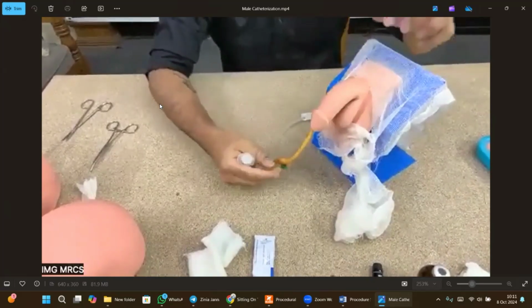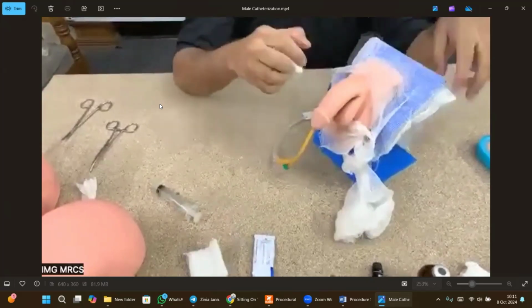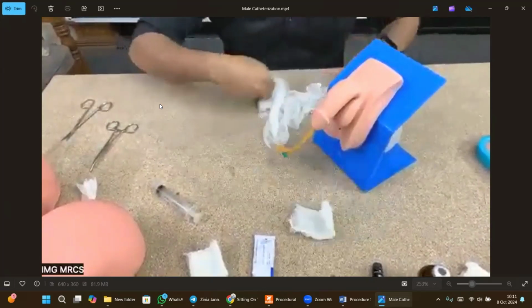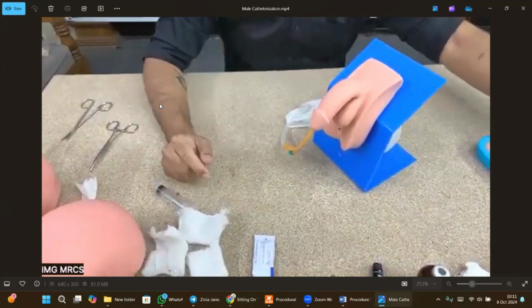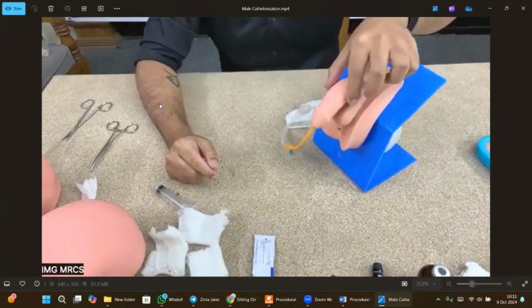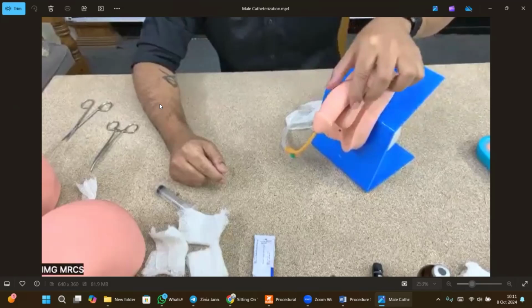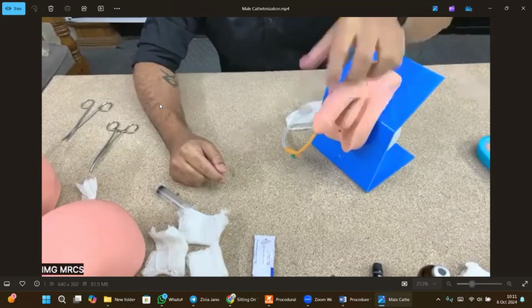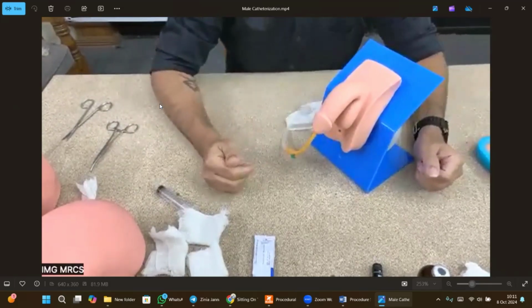And then we will wash the general area, and we are going to remove all the things, okay? We have to dispose of everything into the general waste, okay? At this point, remember, we have retracted the prepuce, right? We have to reposition the patient's prepuce again. Remember that. Then we have to cover the patient and thank the patient, okay?